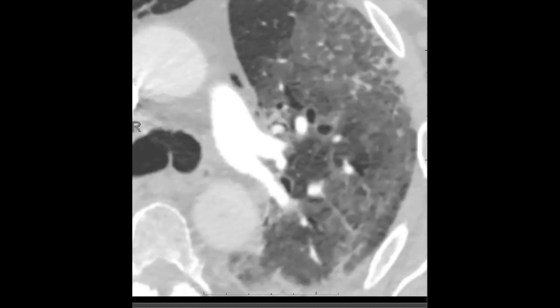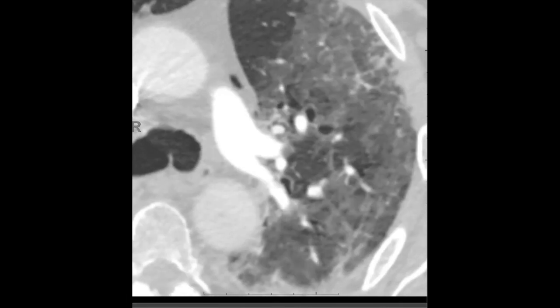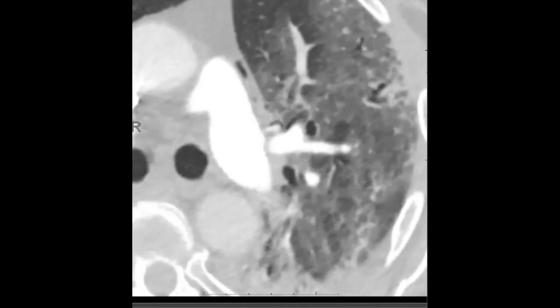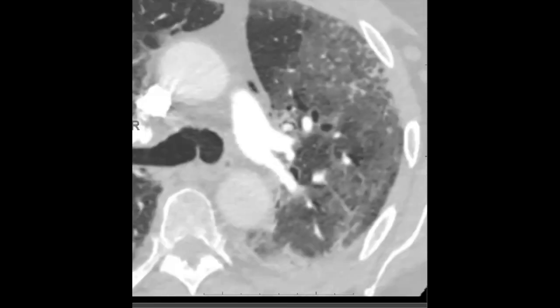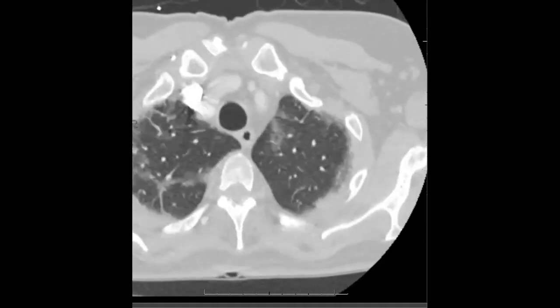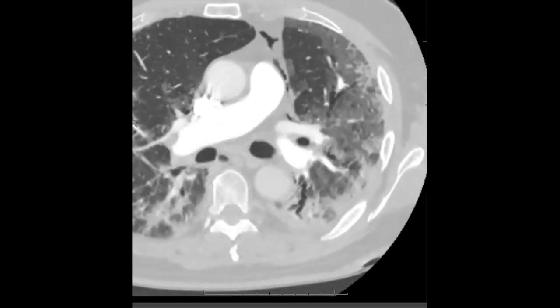This is not a bronchus — this is the associated bronchus that goes with this pulmonary arterial branch. This is ectopic gas, which should not be there. The takeaway is that pneumomediastinum does occur in COVID-19 infection. We don't really know its significance, and it can certainly occur even without mechanical ventilation. This patient was not intubated, so this is not an iatrogenic pneumomediastinum — this is just due to the disease.